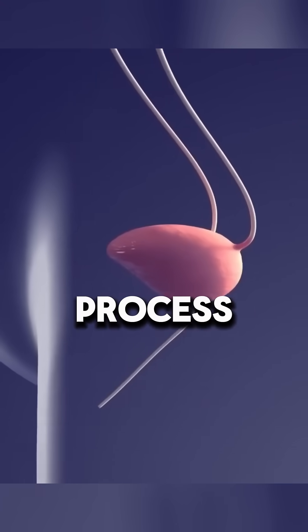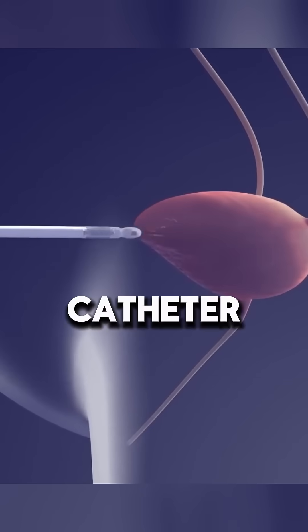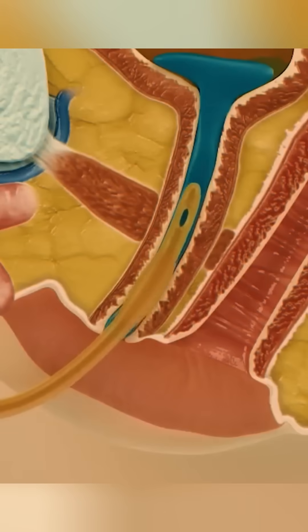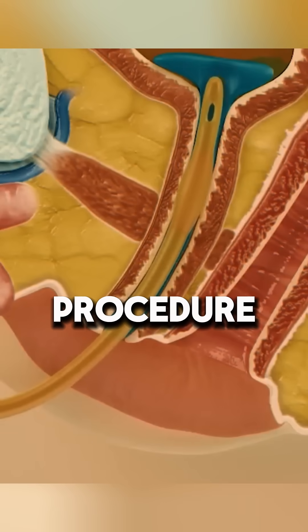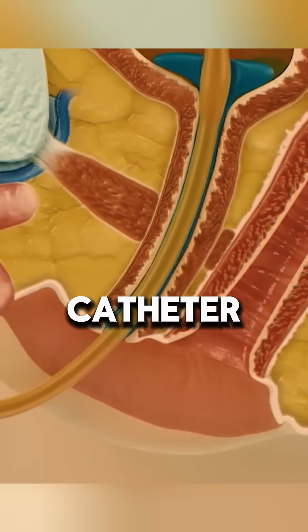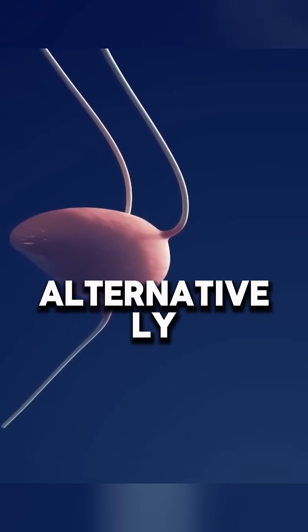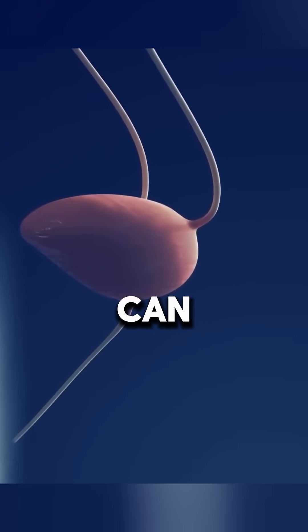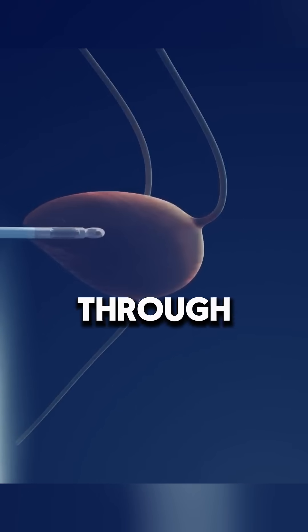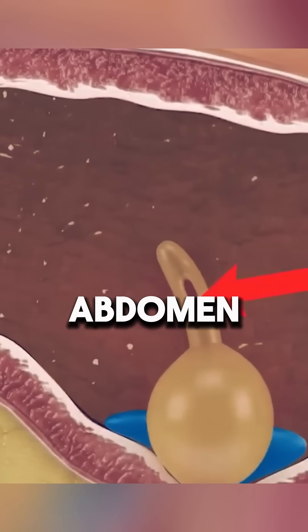The process of inserting a Foley catheter is called catheterization. In this procedure, a doctor inserts the catheter through the urethra into the bladder. Alternatively, it can be placed directly into the bladder through a small incision in the abdomen.